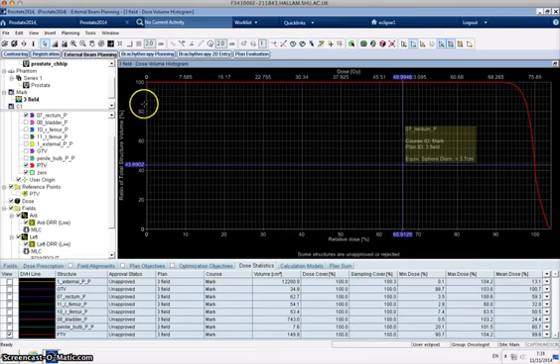So it would be the other way round. So again, I'm not going to show you the answer, but have a think about how you would look up the D98, the D50 and the D2 for this patient. And again, I would recommend that you write those down, and we can use them for comparisons.